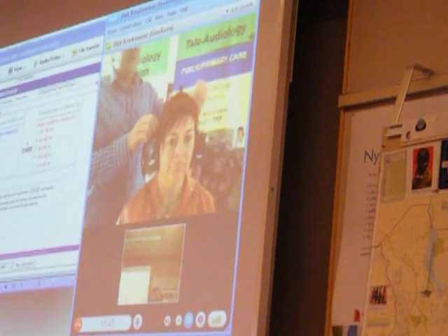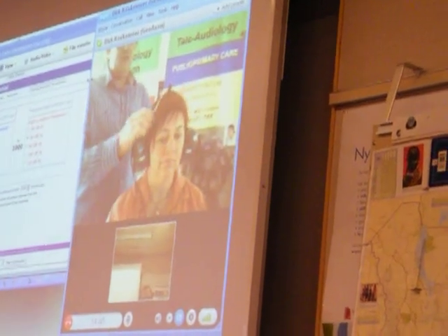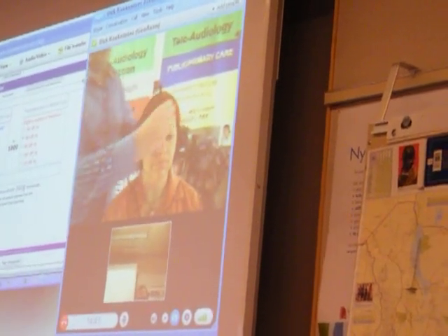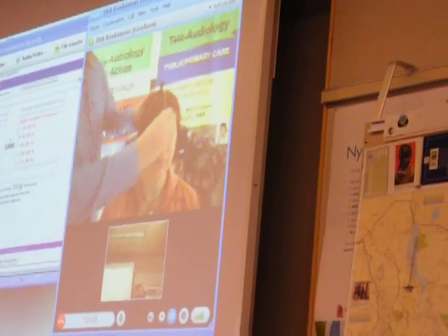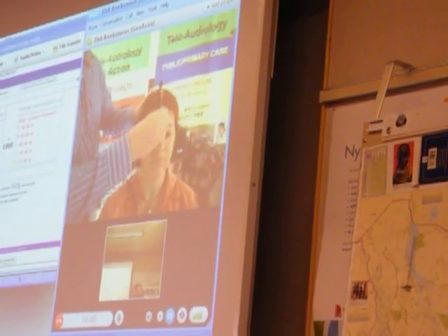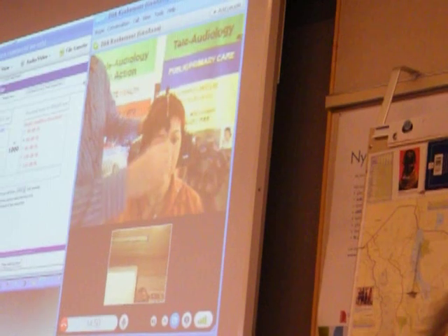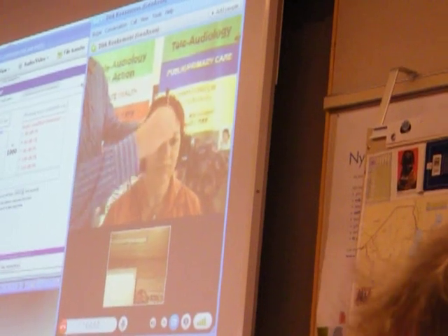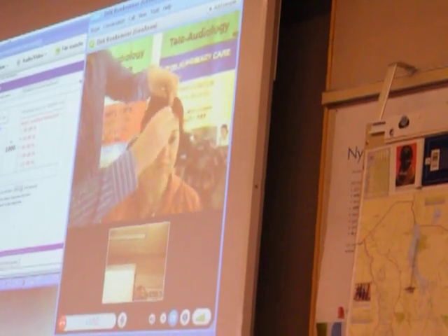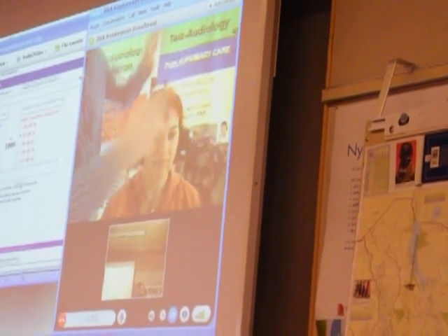Then I take the bone conductor. I swivel the bone conductor onto the patient's forehead like that, and now the bone conductor is on the patient's forehead.